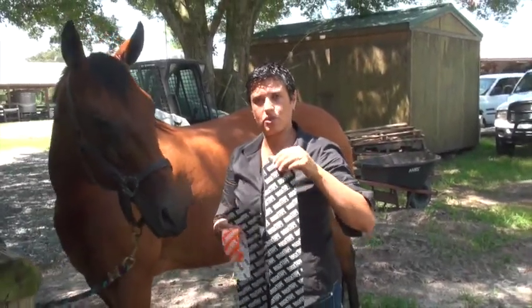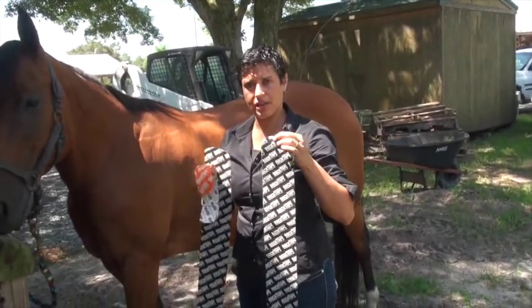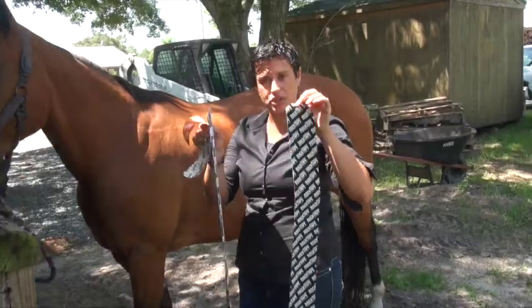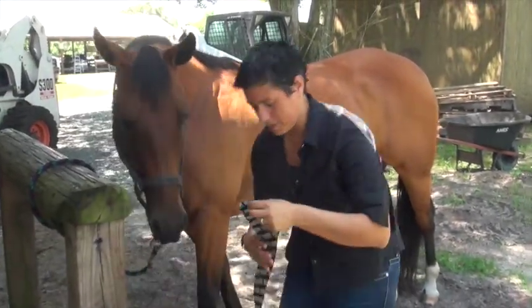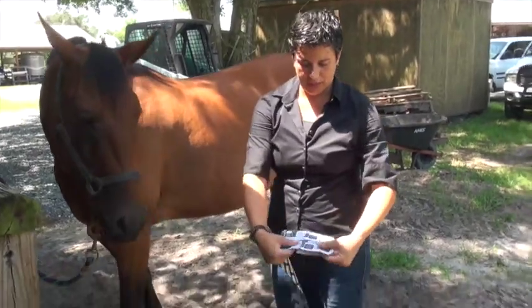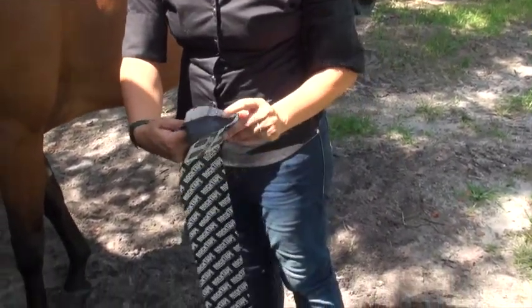So rock tape has a 4-inch width tape that we call the Big Daddy. So this is what we're going to use to run along either side of the horse's back. So I've already measured and cut it into 2 I strips. So I'm going to start with one of them. What I'm going to do is I'm going to tear the paper at the base so that I have a base to lay down.